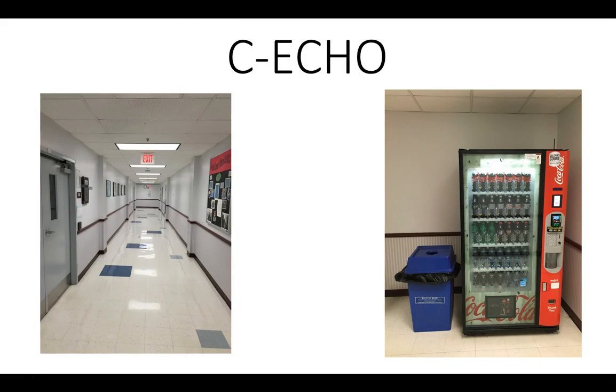Okay, now let's get started with our services. So let's start with C-echo. It's the only one that doesn't move any data. So there is no data object. To stick with our Coke metaphor, I would use C-echo to locate the Coke machine. I wonder if the Coke machine is still there.